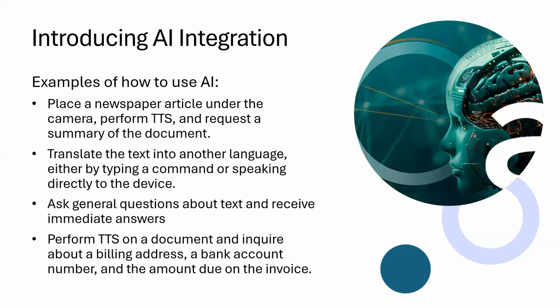That's really cool because if you have low vision and you're trying to look at a document with a lot of information, you may get some eye strain if you're trying to find something very detailed. For example, if it's a bill and you're trying to figure out the amount of the bill, you're now looking down through it, trying to focus and find what you're looking for.